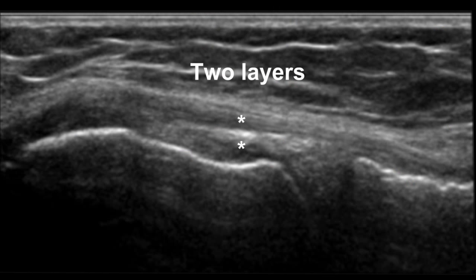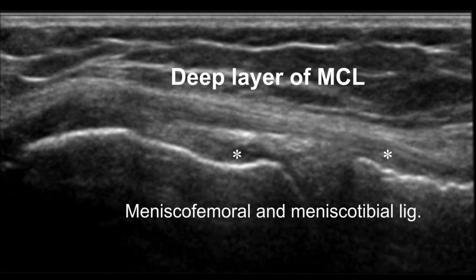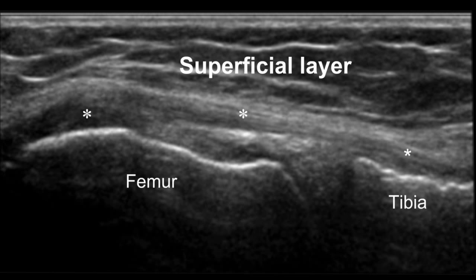The medial collateral ligament is a two-layer structure. The deep layer is composed of meniscofemoral and meniscotibial ligaments, tightly attached to the medial meniscus. The superficial layer is made up of broad and flat fibrous connective tissue, running from the medial femoral epicondyle to its tibial attachment.